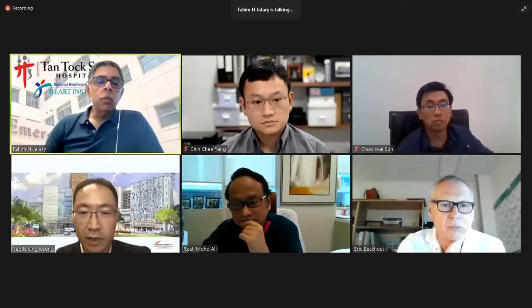And I guess maybe because I've done it before, I was a bit more confident that I could avoid that particular trouble. But you're right. We have read those case reports of using the guide liner, and I've done that as well, but not in the kissing fashion. One alternative approach, if you're so worried about losing the side branches, could be to actually stent the circumflex, crush the stent, and then go ahead and ablate the LAD. That's been described. Sounds complicated. Yeah, it is complicated, that's for sure.